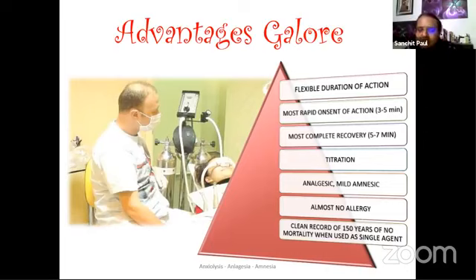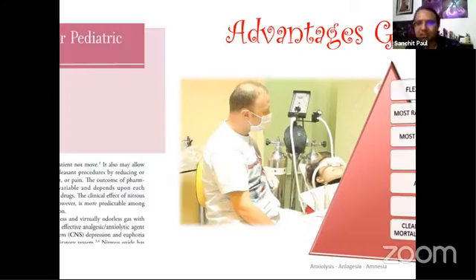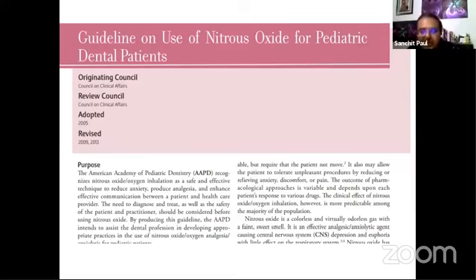And one of the things always weighing on our minds is, is it safe? So let me put it on this platform in a very clear and sound way. Nitrous oxide alone has a clean record of 150 years of no mortality when used as a single agent. Yes, we can use it in combination with other agents too, but for that we need better skills, expertise, and understanding. Alone, nitrous oxide can be used by any dentist all over the world.